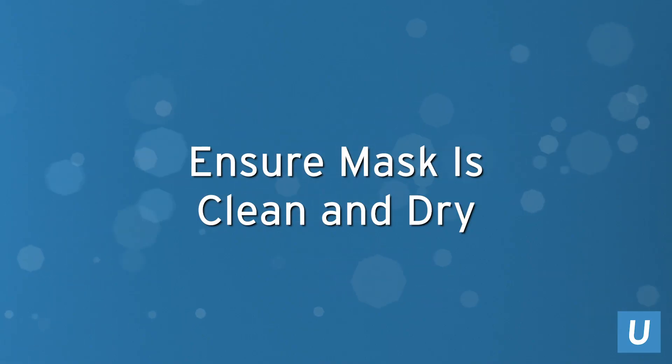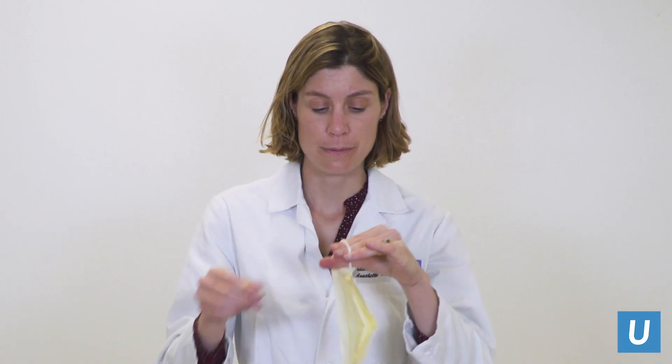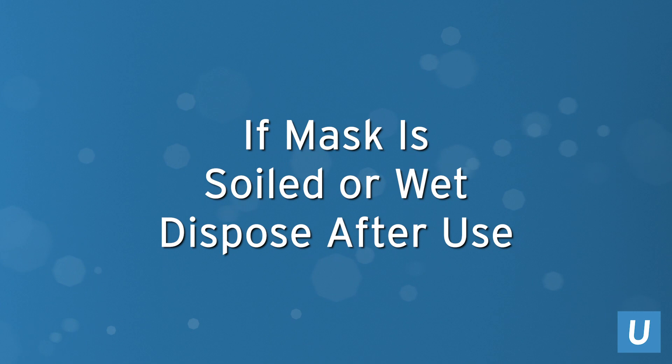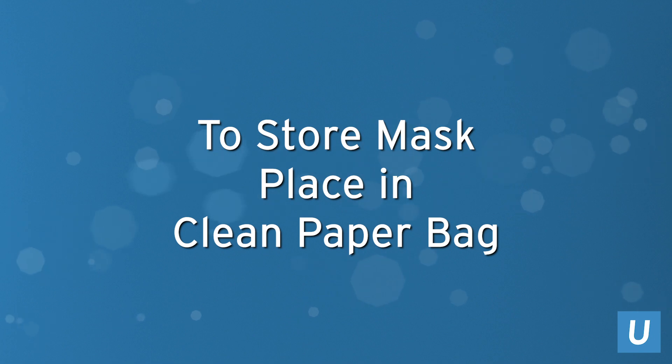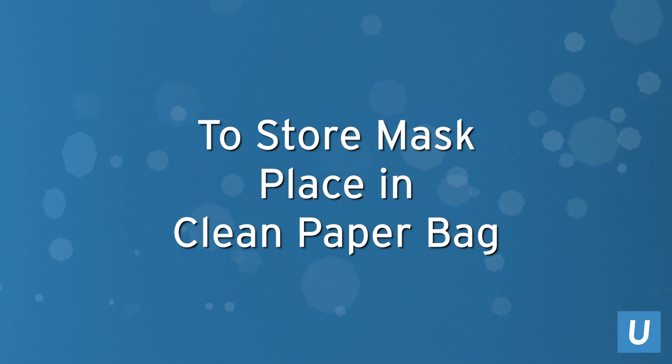You should always check your mask to ensure it is clean and dry if planning to reuse. If your mask is soiled or wet, you need to dispose of the mask after use. If storing for reuse, place it in a clean paper storage bag to keep the mask dry.